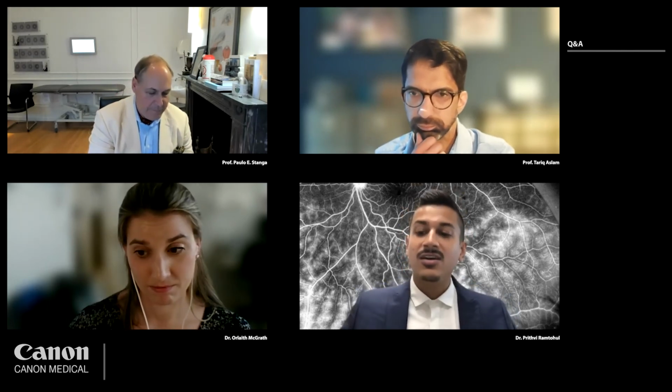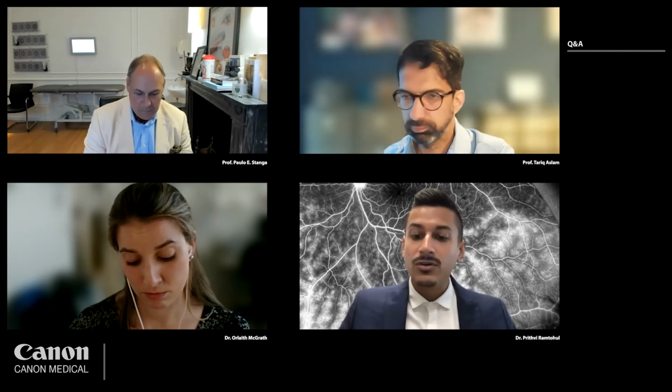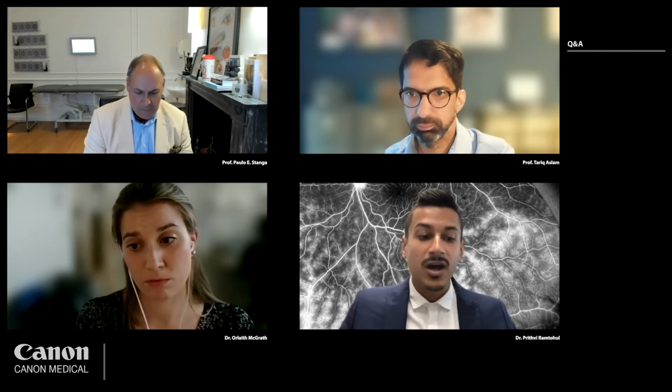I think that using OCT, we can have beautiful images that can characterize the choroidal structure, but ICG angiography may be useful for assessing choroidal vascular hyperpermeability. And this finding is mostly used to treat CSC patients. So for now, I think that ICG-A may remain a required imaging finding prior to treatment in CSC patients.